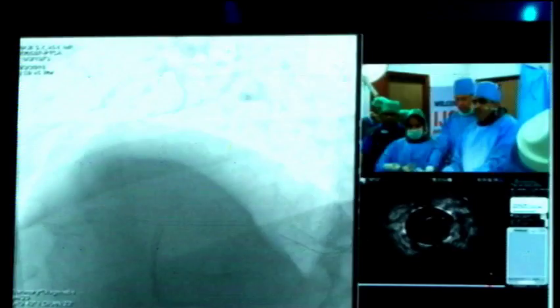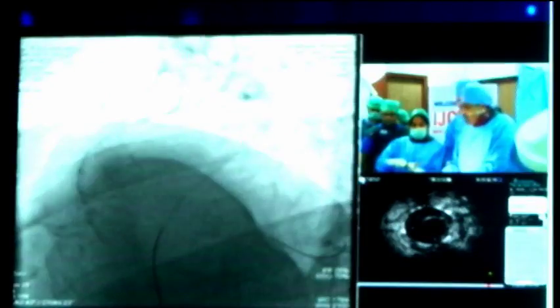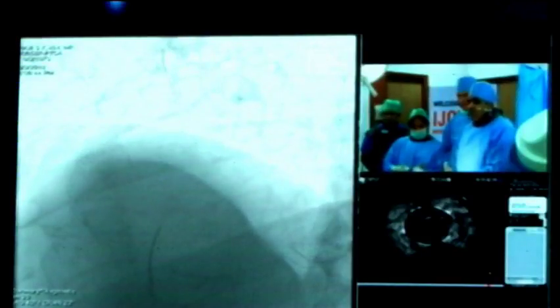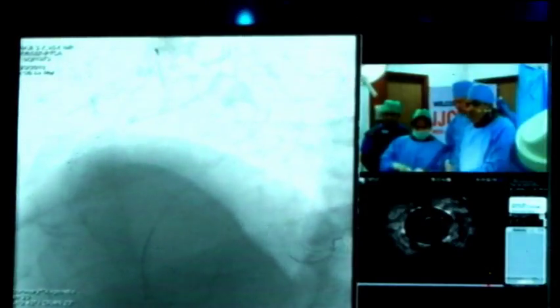And can you see the angios? Show the angio, please. Can you see the angio? No, we can't see. Can you just tell them to show it? This is angio. Are you able to see? Yes, we are able to see. Okay, go ahead. You can see this left side injection. The stents in LCX and LAD are patent. You can see the distal part of the RCA through collateral circulations. Then this is a simultaneous injection.